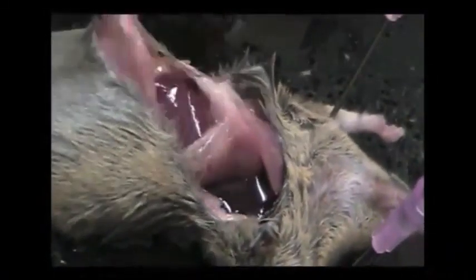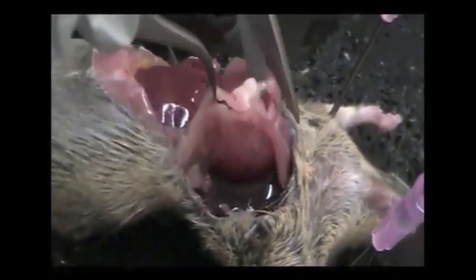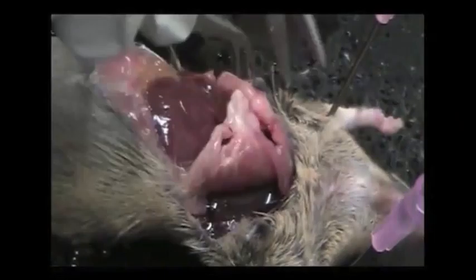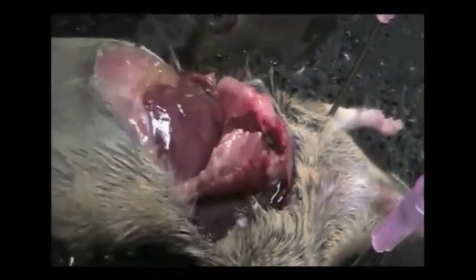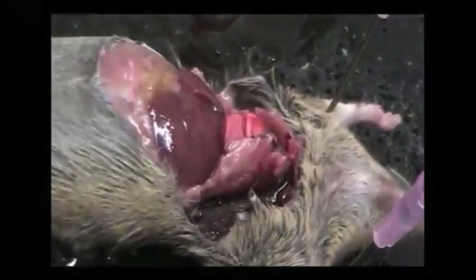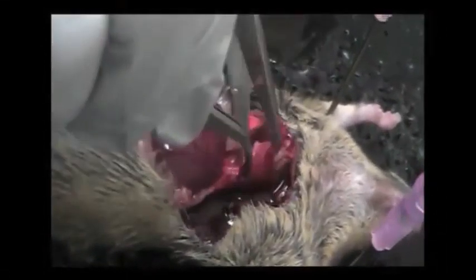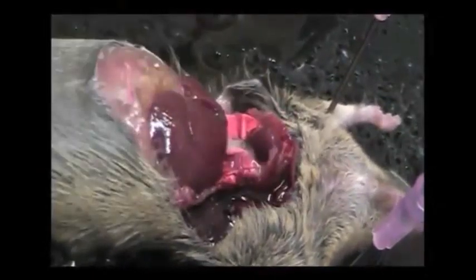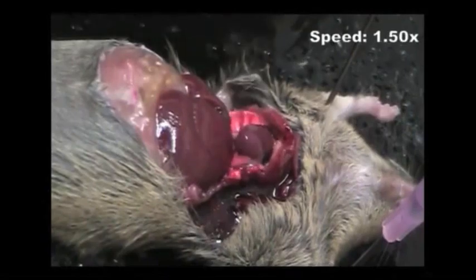So now it's slowed down a little bit, and what is actually happening now is I'm exposing the underlying tissue and the liver and all the under organs. I'm cutting up through the ribs to hopefully expose the heart, because at this point in time you cannot see the heart until I cut the ribs away. There you can now start to see the heart, and even though the heart is still beating, that is just a residual action of the animal.